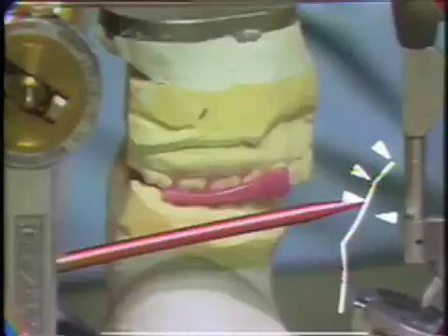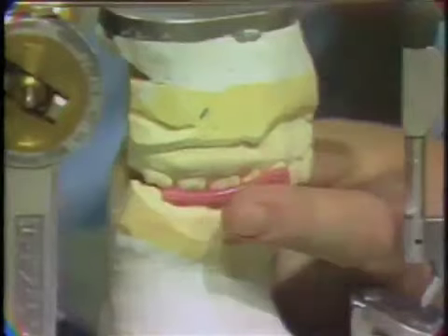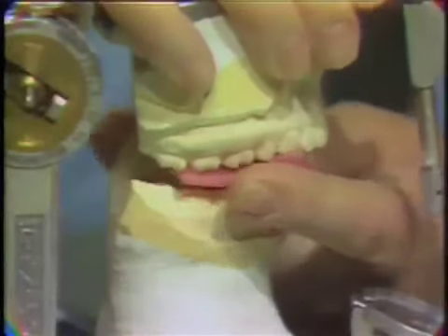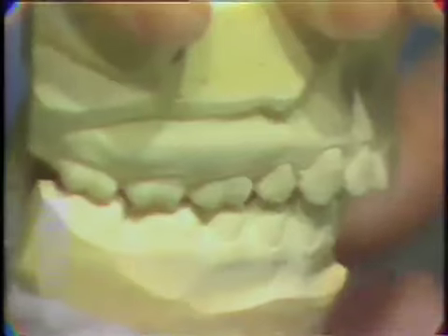So we would want to duplicate this arc on the articulator, so that as we take the centric relation registration from between the teeth and we close the teeth down into contact, we would have the same first contact on the cast as we have in the mouth.